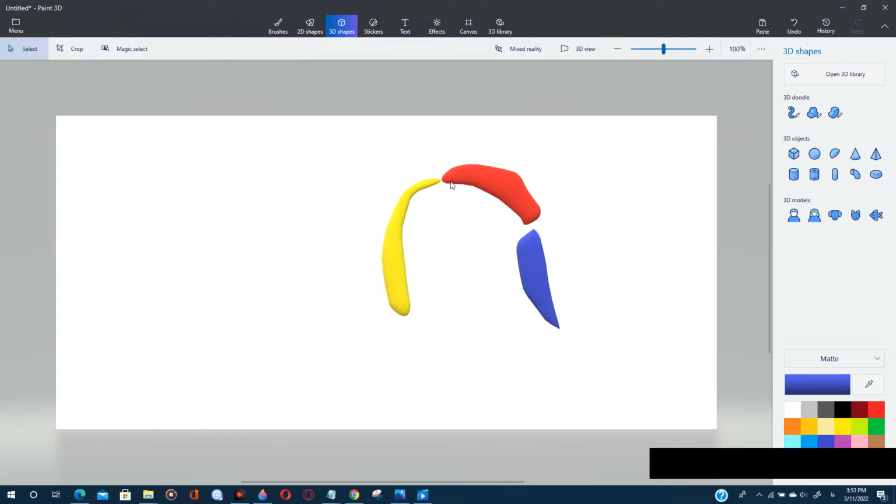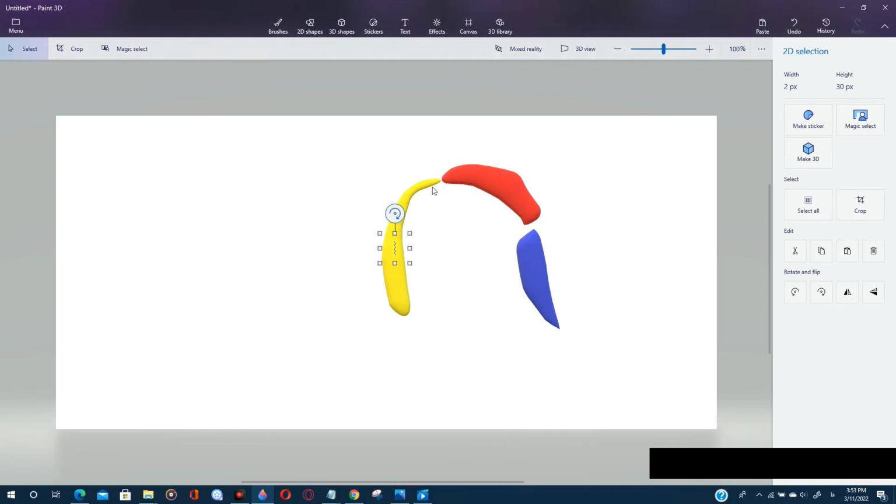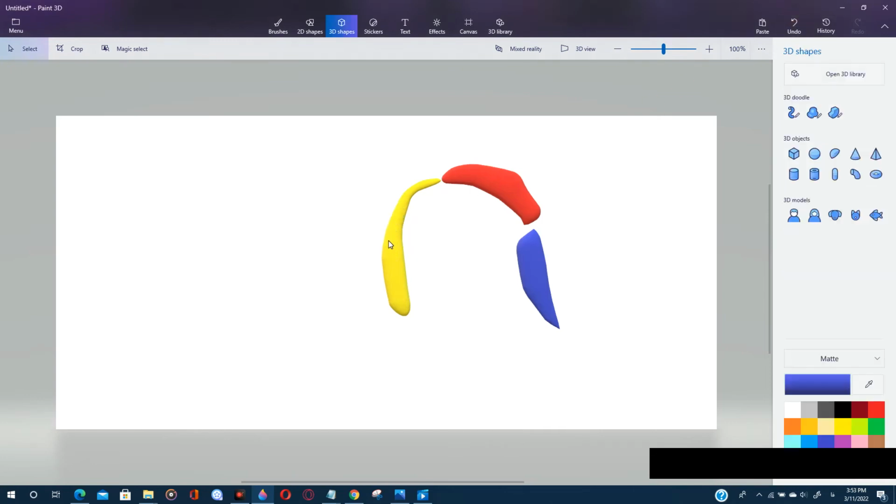Each part of the LV wall receives flow from one part of the coronary artery. For example, this is the septum. This septum receives flow from the LAD, and there are coronary arteries supplying this region, and we say territory of the LAD and territory of, for example, the LCX.